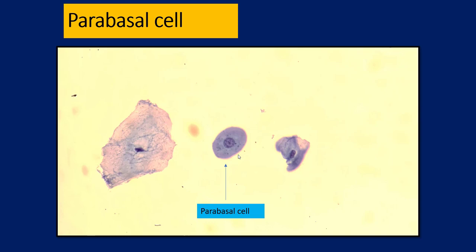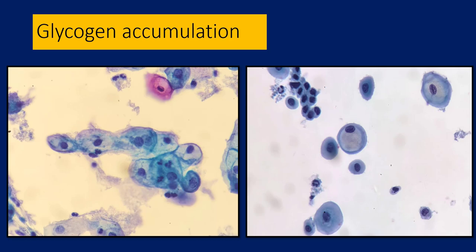The parabasal cell is a much smaller cell than a superficial squamous cell, with an ellipsoid/oval shape and a centrally placed nucleus. The nuclear size is roughly that of an intermediate squamous cell, slightly larger. Parabasal cells are usually not found in most smears, but in certain situations like atrophy, they become the predominant cell component.